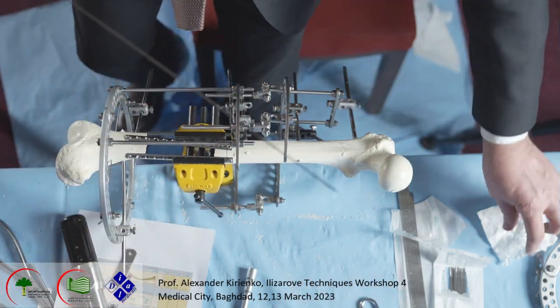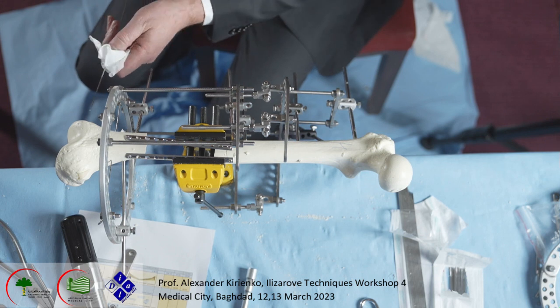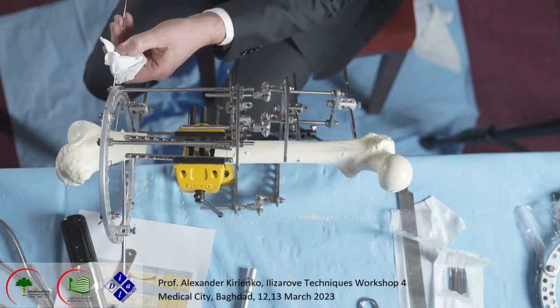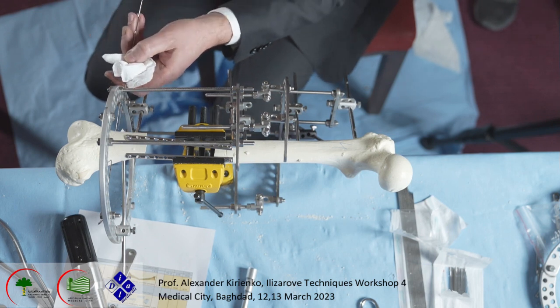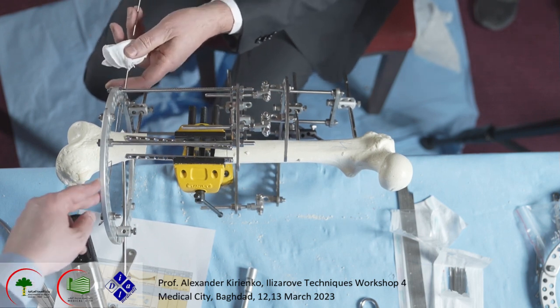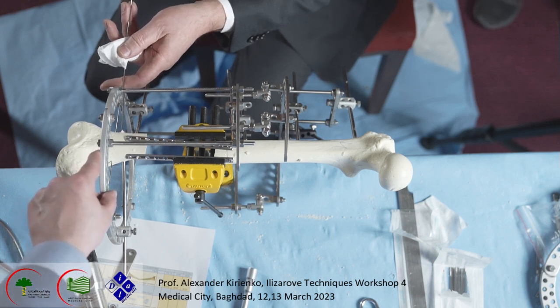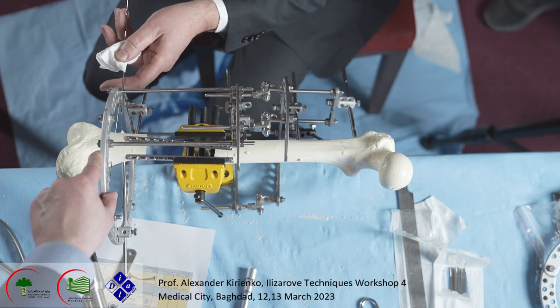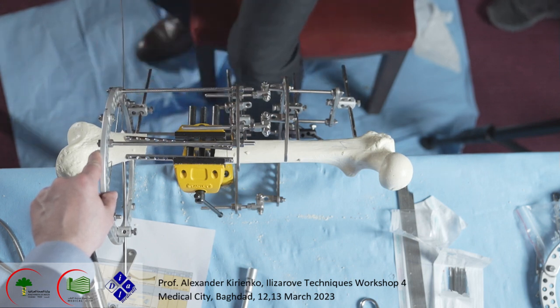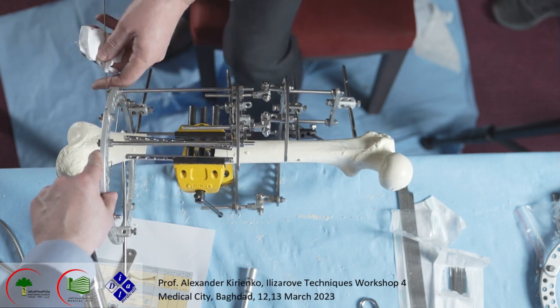Okay, take this. I don't do too much crossing, just a little bit. Put here from below. Okay. Look for 3 holes. Okay.